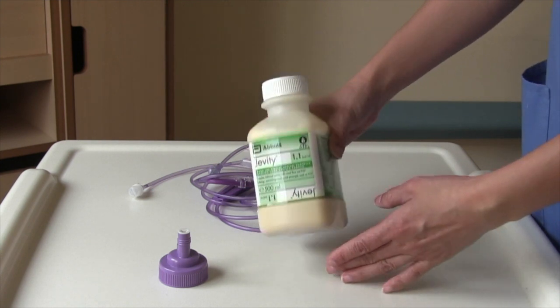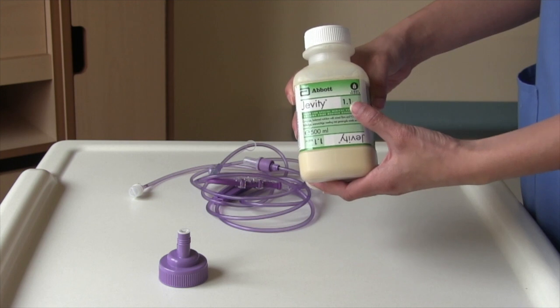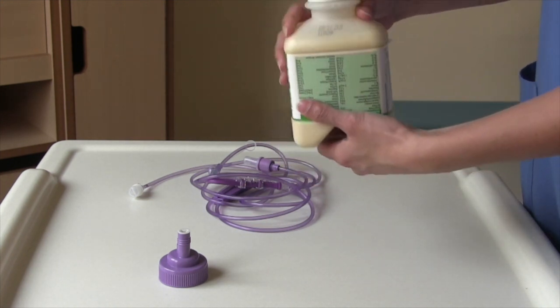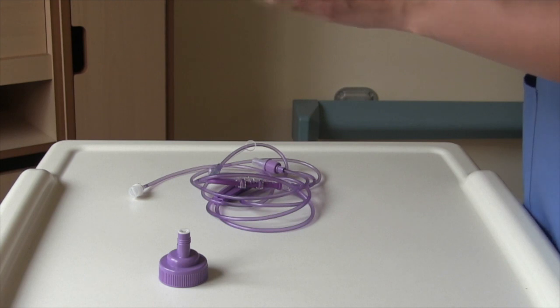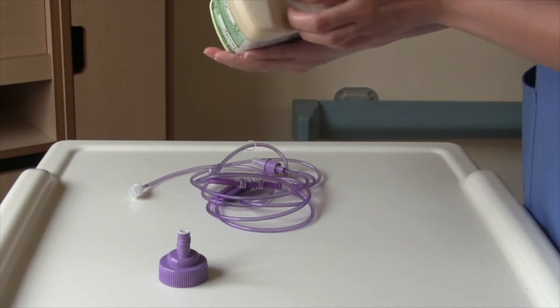First, you will want to make sure the name of the bottle matches what the dietitian has recommended for your feed. The feed regime is different for each individual. Check the expiry date to ensure the feed is within date. Shake the bottle to mix the contents while looking for any lumps or discoloration. If you notice this, use a new bottle.